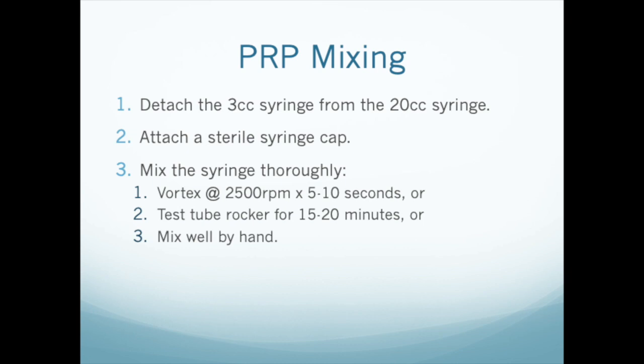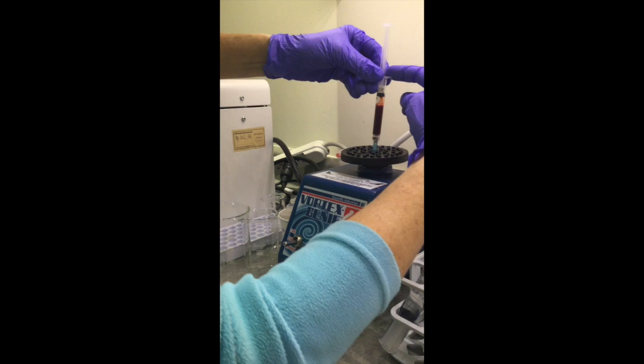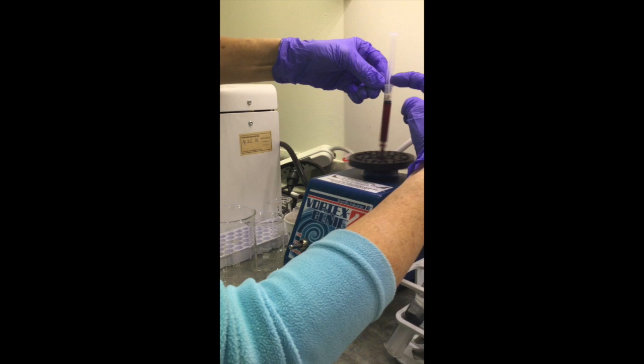Detach the 3 mil syringe and put a sterile syringe cap on it. Mix well. If you have a vortex mixer, you can mix it for 5 to 10 seconds at about three quarters of maximum speed, which is 2500 RPM. If not, just mix well by hand or put it in a test tube rocker for 15 to 20 minutes.